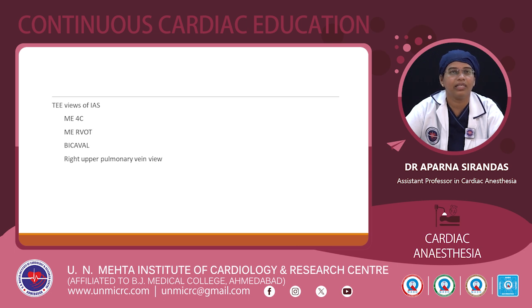So normally the TEE views of the interatrial septum are the midesophageal 4-chambered view, midesophageal RVOT view, bicaval view, and right upper pulmonary vein view.